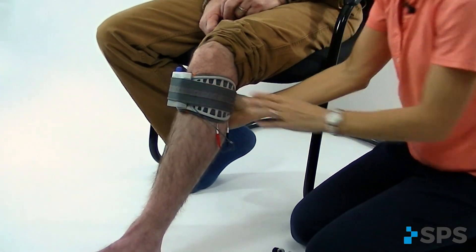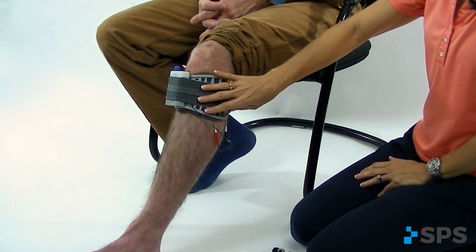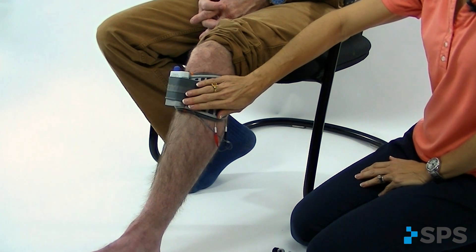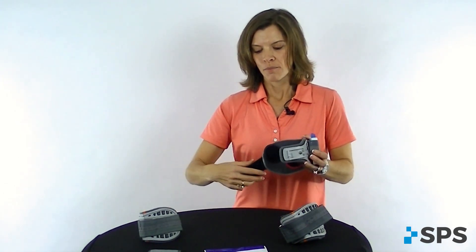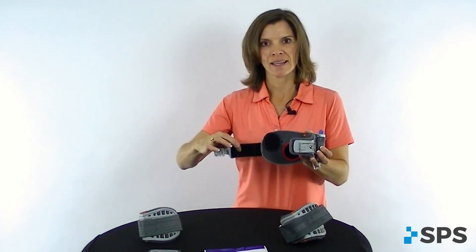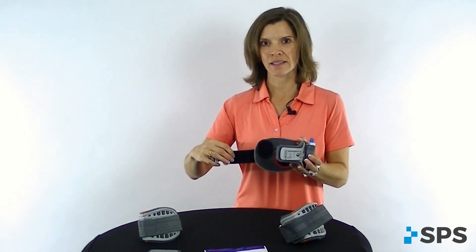If you find that the patient gets great dorsiflexion when you're using your hand to mimic the cuff, but when you place the cuff on the leg they lose that dorsiflexion, you might need to have the cuff a little bit tighter. Adjust the black strap by changing the Velcro piece here and make it the size you need to fit more snugly. You might need to go to a smaller size cuff if that doesn't work.